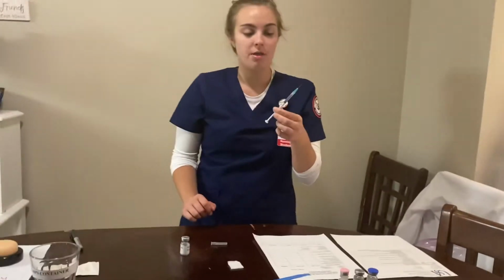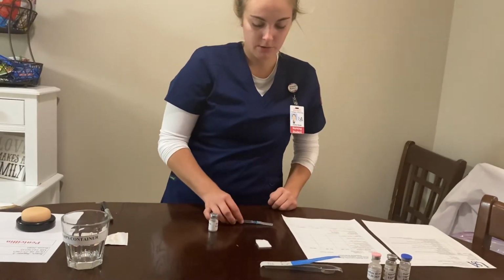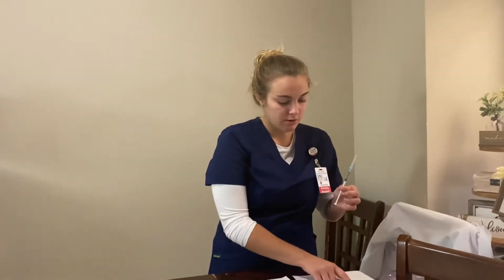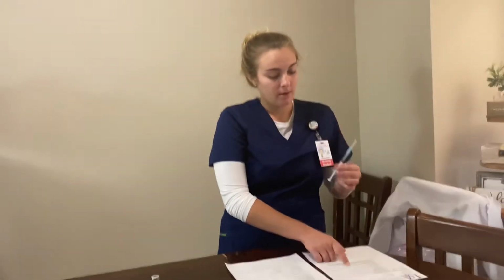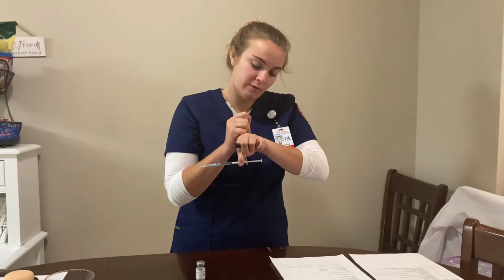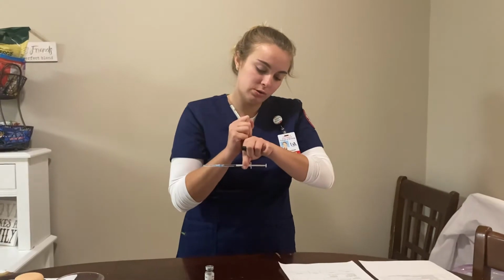I then would verify with another nurse that I have the correct amount, and then I would recap my syringe by using the scooping method. I would go to my MAR and check the 5 rights again. Jaguar Jones, heparin, 5,000 units, subcutaneously, every 12 hours. I then would label my syringe by the medication. So we have heparin, the dosage 5,000 units, and the patient Jaguar Jones.